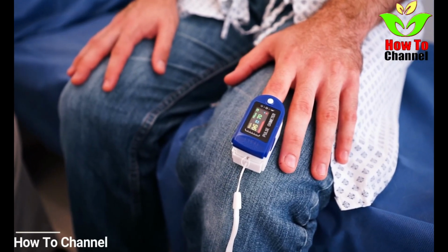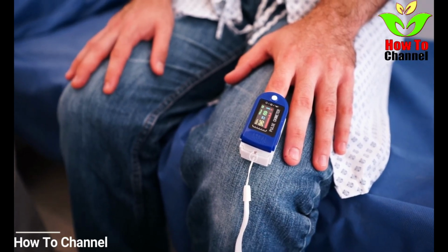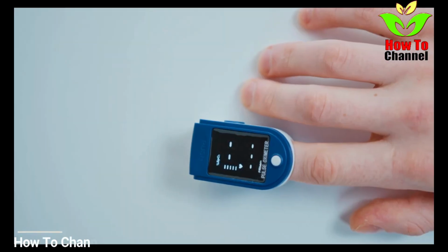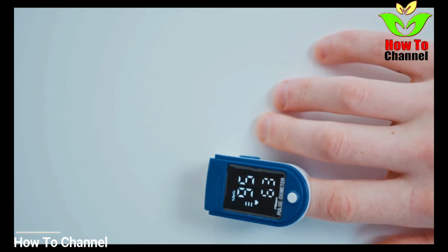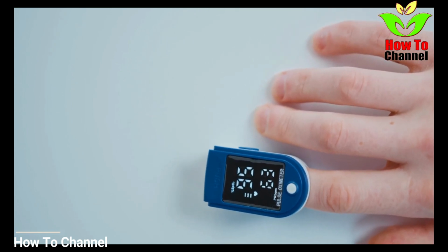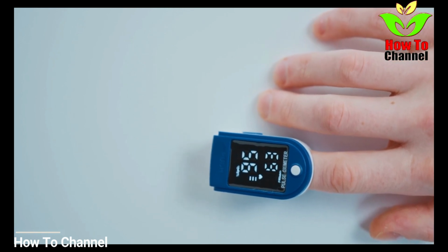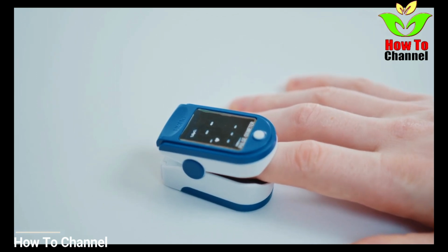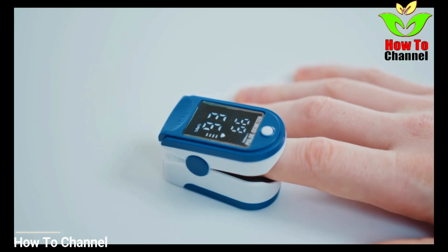Pulse oximeters emit two wavelengths of light, red light at 660 nanometers and near-infrared at 940 nanometers, from a pair of small light-emitting diodes located in one arm of the finger probe. The light that is transmitted through the finger is then detected by a photodiode on the opposite arm of the probe. From this, the probe can calculate the relative amount of red and infrared light absorbed, and this can be used to ultimately determine the proportion of hemoglobin bound to oxygen.